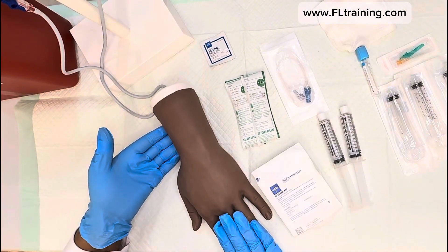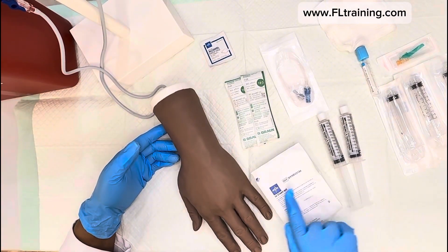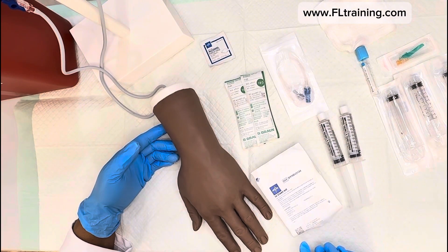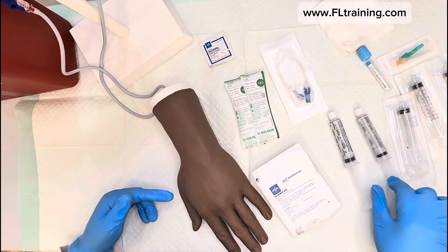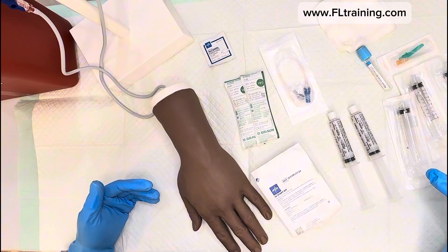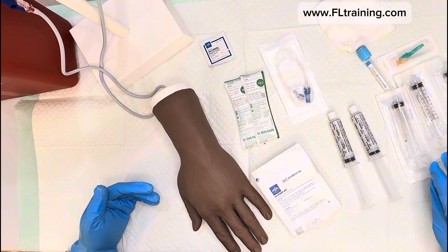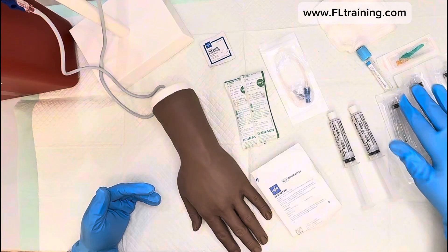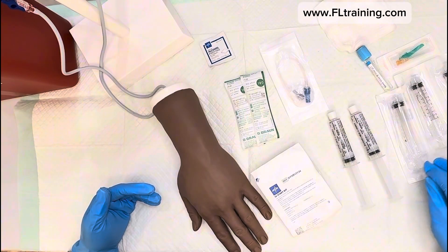We have our patient and our IV start kit, which contains an alcohol prep pad, a dressing, a two-by-two gauze, tape, and a tourniquet. We have our saline flushes — I like to have two of everything in case one drops or gets contaminated. We also have syringes that don't have anything in them.